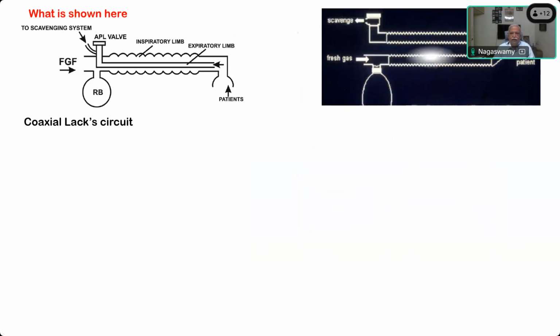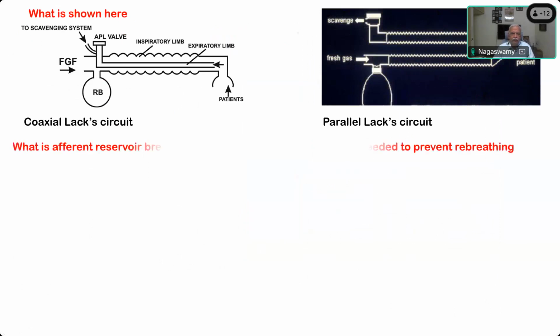Fresh gas flow is coming here. Lack, sir, coaxial system. This is a coaxial Lack. Somebody mentioned coaxial earlier. That was a parallel one. This is the coaxial Lack circuit. And this is the parallel Lack circuit which you see. Okay. Just for comparison's sake.